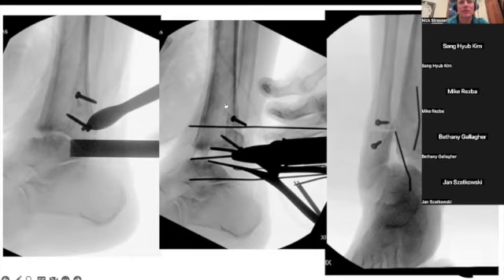I don't have it. I'm intrigued by it though. What is it? It's basically an instrument that's kind of like the power rasp, I guess, but it has an osteotome that goes on, and it can prep the joint and allows you to decorticate and remove all the bone. It works pretty well. It's obviously dependent on how sharp the osteotomes are. Who makes it? I'd have to look it up. I'm not sure.